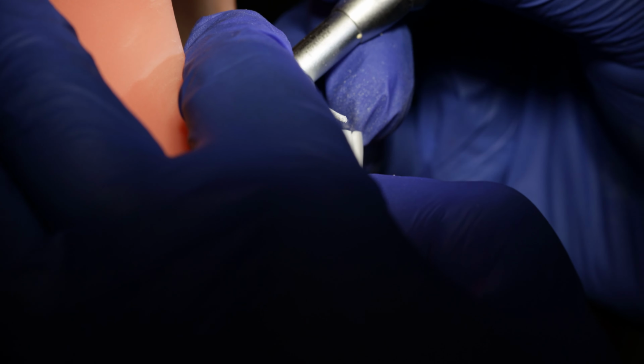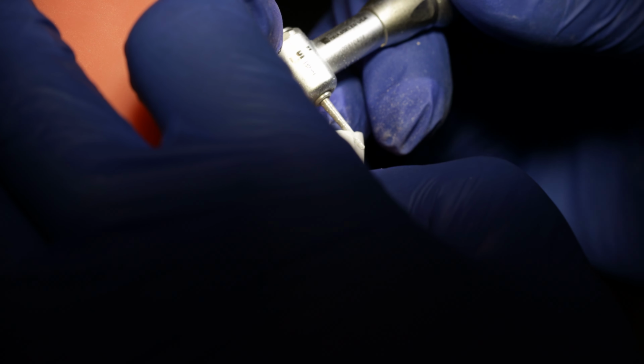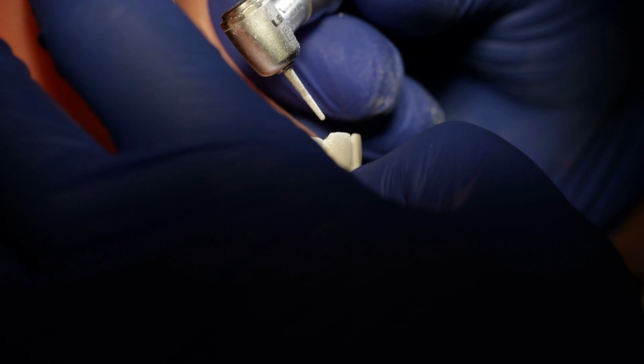That line of thought doesn't just apply to the incisal edge over there. It's also like the mesial and distal ridge that we're creating. There's got to be some sort of protrusion so that it doesn't just slide right off. But don't take that too far. The mesial and distal ridges that we're creating, they need to be flush, they need to be smooth. They can't exactly be at a 90-degree angle. It's not like a shoulder, you know what I mean?